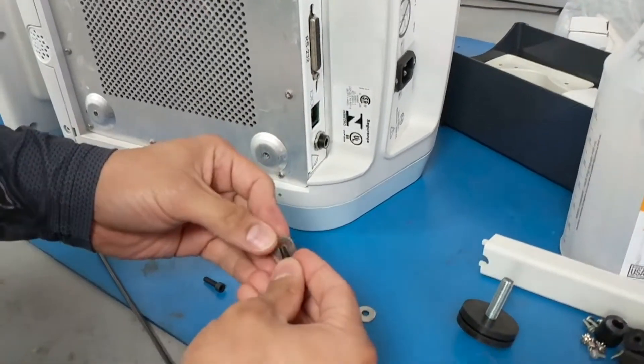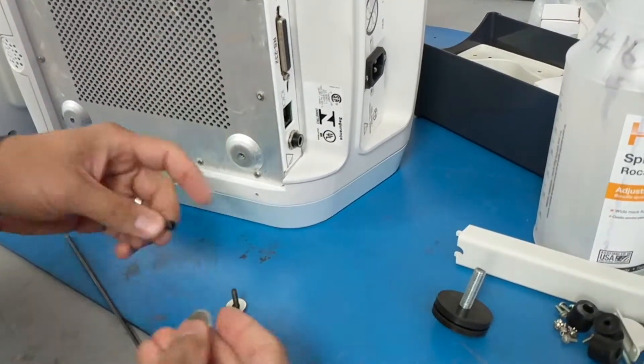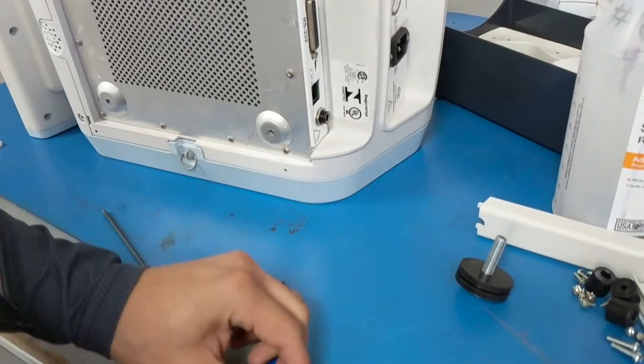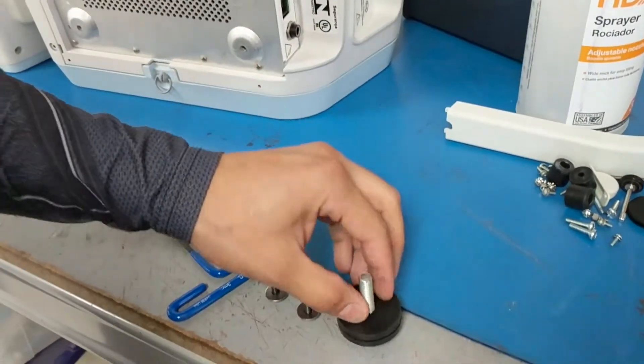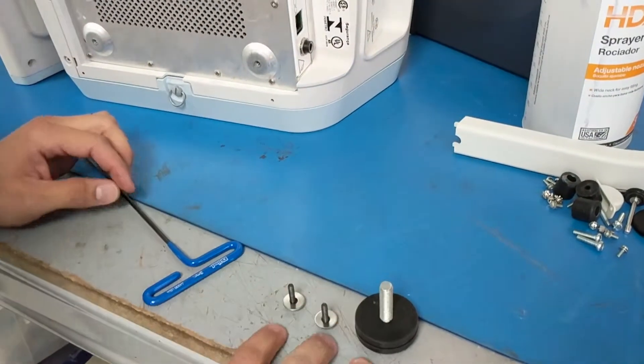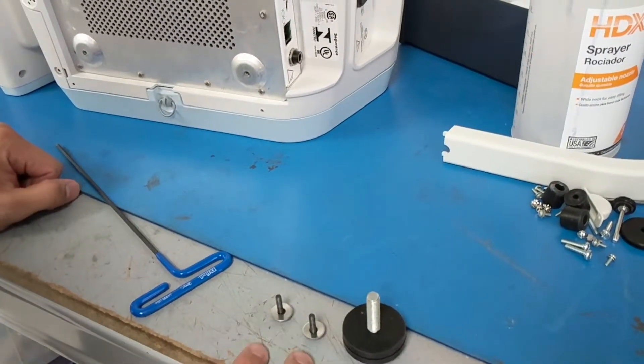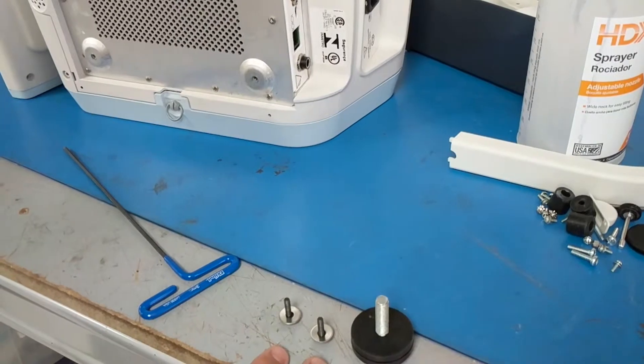Now we're going to put these two, one washer per screw, and we're going to get those ready. We're going to set aside the four feet and we're going to have our larger screw. So we have three screws that we are going to use to mount the V60 onto the cart.